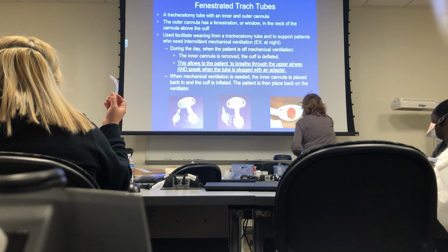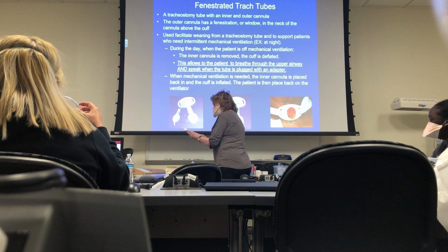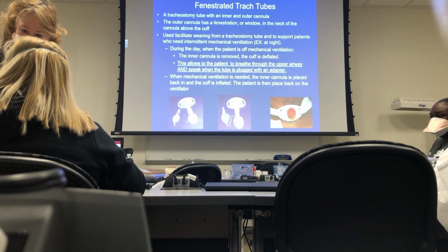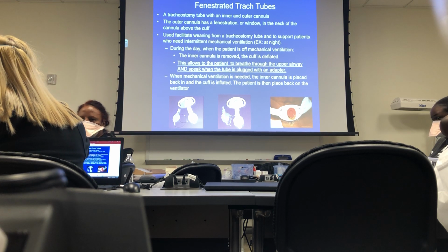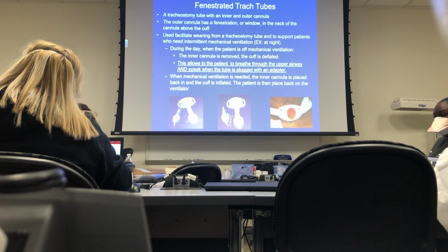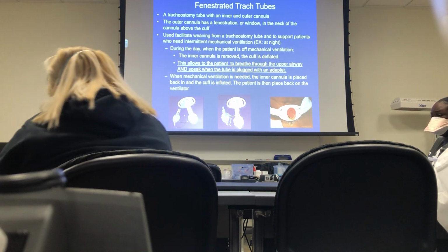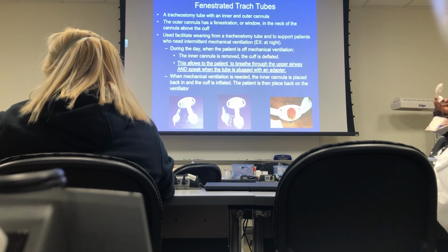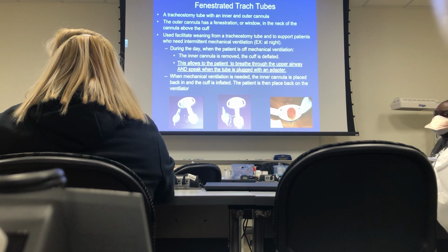you would put in one of these little plugs, okay? I'll show you what that looks like. I don't know if this is going to fit on that. Does that have a clip? Oh, there we go. Okay, so when the patient breathes in, if they had the trach and the plug on there, they're breathing in through their mouth and air goes out through their mouth. Because this is plugged, they can also talk because they can use their vocal cords, all right? At night, when they have to go back on the vent, you take the plug out, you put the inner cannula without the hole back in, and you inflate the cuff. Okay? Everybody with me? Because that plug won't allow you to breathe through here.